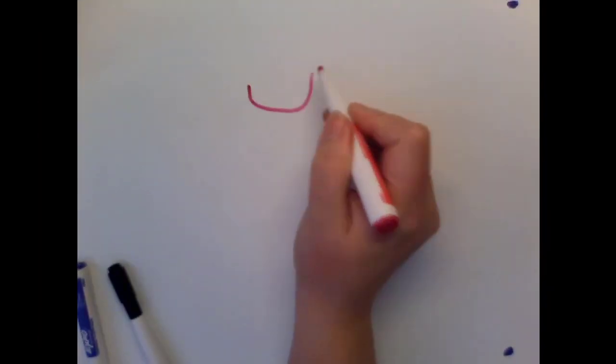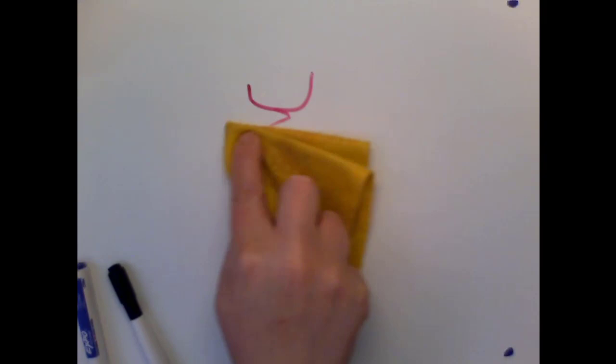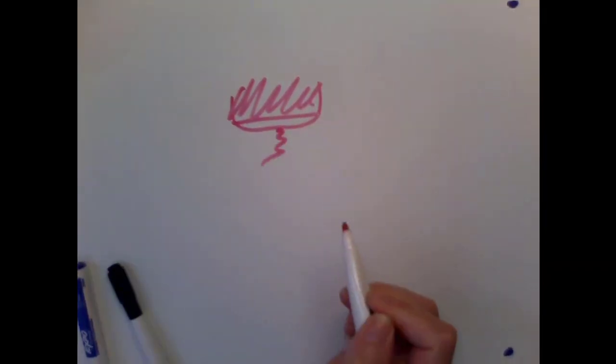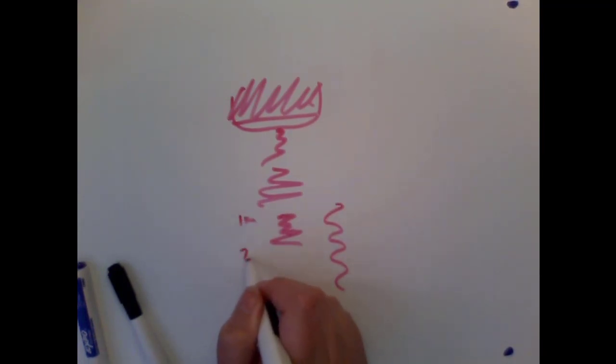So again, we have our transducer. No backing material, it would just ring, ring, ring, ring, ring, ring. Beautiful tone all the way out. It'd be one pure, we'll just say 5 megahertz. But now, with our backing material, again, we have that backing material here. Instead of just ringing forever, we get these little chirps, and they actually have kind of a weird profile to them. They have multiple frequencies within the chirp. And so now we are no longer getting a pure 5 megahertz tone. We're getting this weird chirp that has anywhere from maybe 1 megahertz to 7 megahertz.